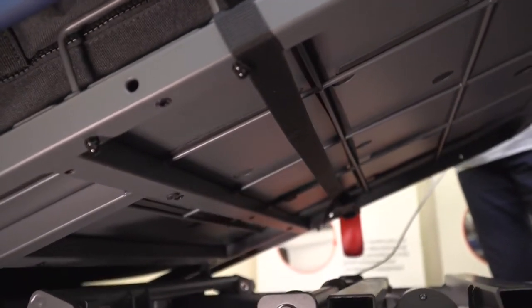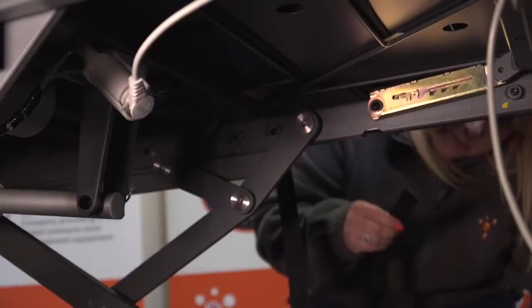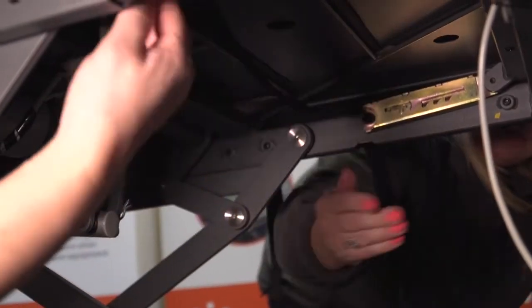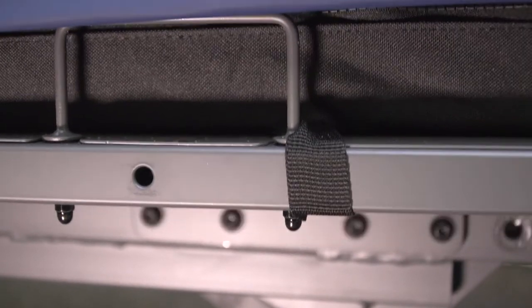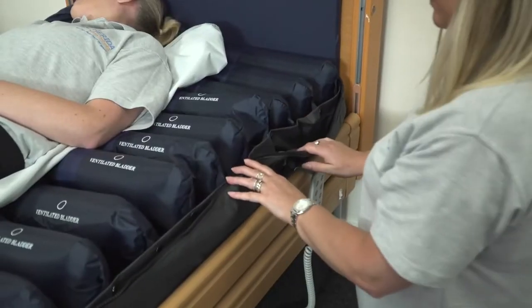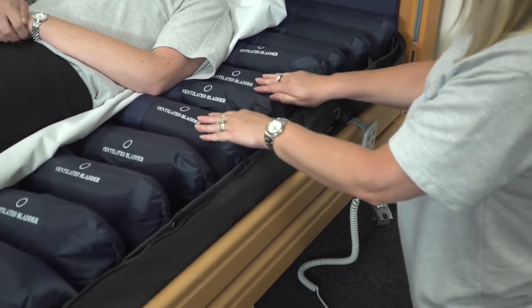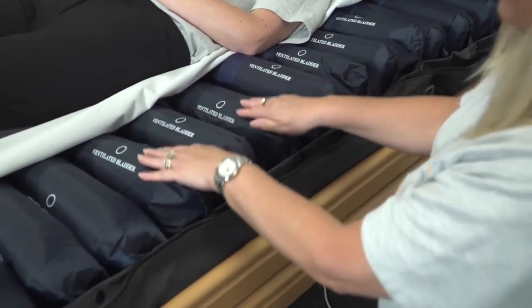Upon installation, it is always important to ensure that the securing straps are attached to the moving parts of the bed. The moving parts are indicated, such as the knee break and the backrest. As you can see here, the strap from the bottom of the mattress is secured through the moving parts of the bed frame. Never secure the straps to the outer edges of the non-moving bed.